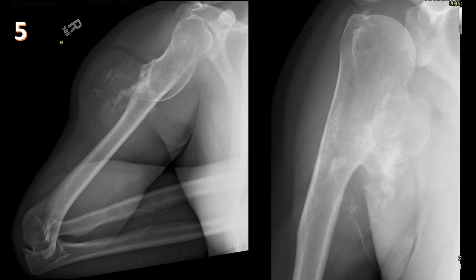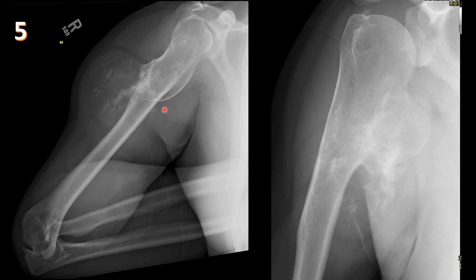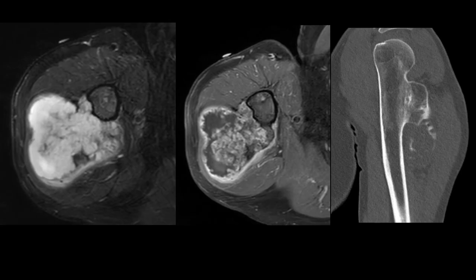Case five: AP and lateral views of the right proximal humerus show an osseous lesion arising from the proximal humeral metaphysis with continuation of the medullary cavity into the lesion — classic osteochondroma. However, there is a large lucent component at the tip with chondroid matrix and calcification. This large chondroid component at the tip immediately raises concern that this osteochondroma has degenerated into a chondrosarcoma.